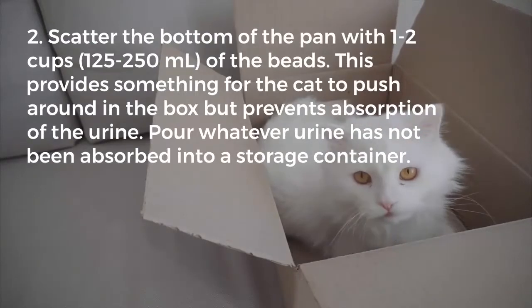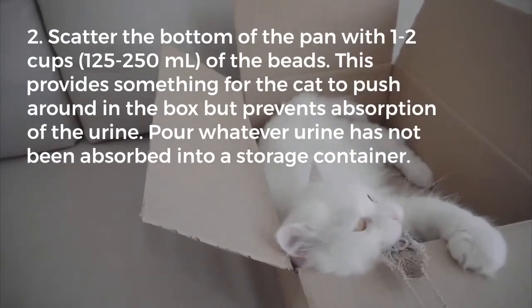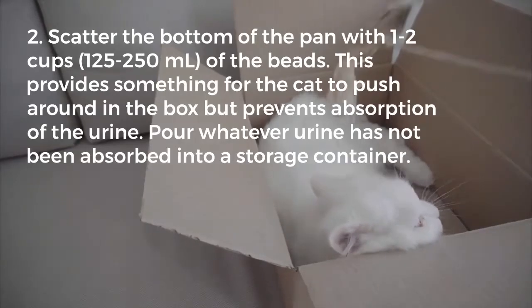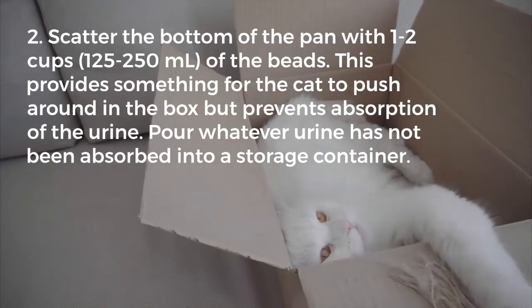Second, scatter the bottom of the pan with 1 to 2 cups of the beads. This provides something for the cat to push around in the box but prevents absorption of the urine. Pour whatever urine has not been absorbed into a storage container.